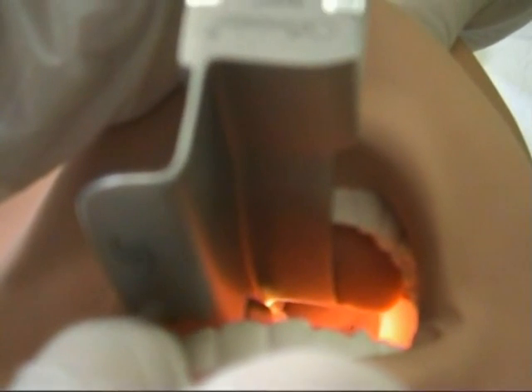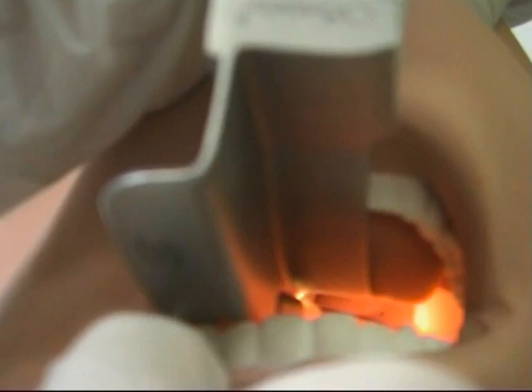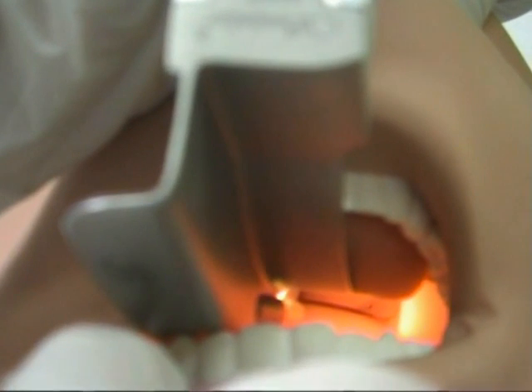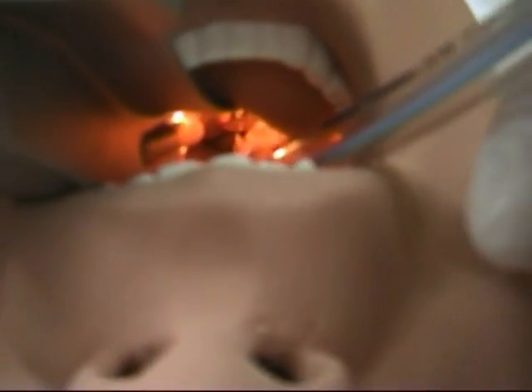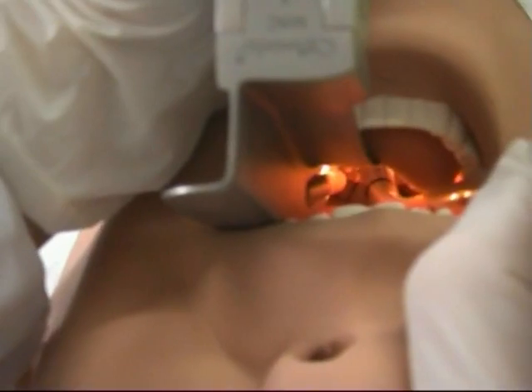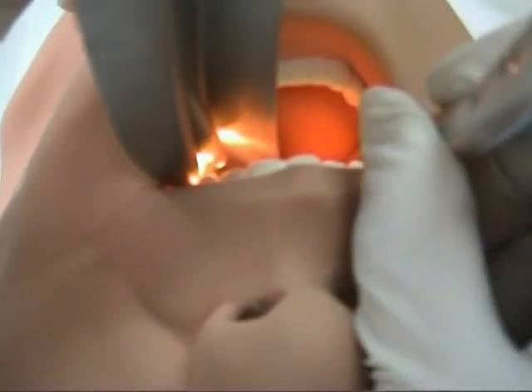Avoid bending your wrist or rocking the blade against the patient's teeth, which can cause damage on these or soft oral tissues. Hold the endotracheal tube in your right hand while maintaining the view of the vocal cords. Then pass the endotracheal tube through the vocal cords until it disappears into the trachea. And advance the tube until the balloon is 3 to 4 centimeters beyond the vocal cords.